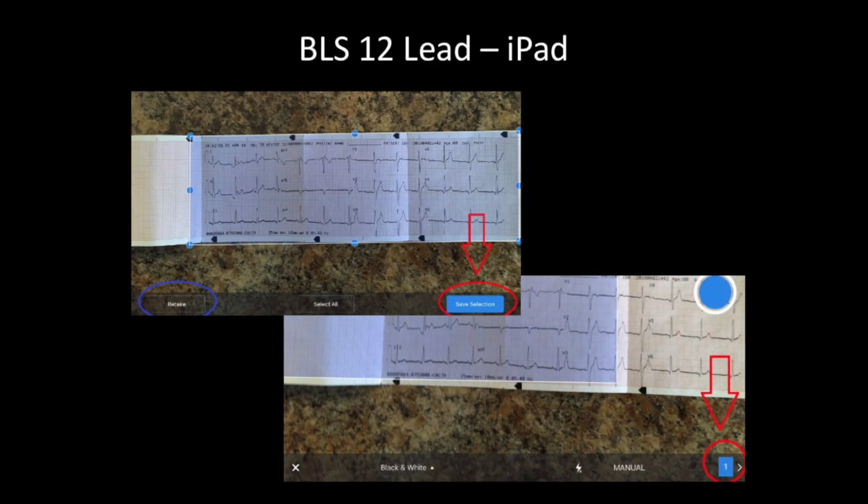What you can see on the screen is a button that says save, and then it goes from save to 1. Yes, there are 2 steps. This is the picture, and this is save, the first thing you see. You can retake if you need to, if this wasn't good. Save. Then the next screen that pops up has a little 1 at the bottom right corner. Just click on that 1. So it's fairly simple: you click the button and then stay in the right-hand corner.